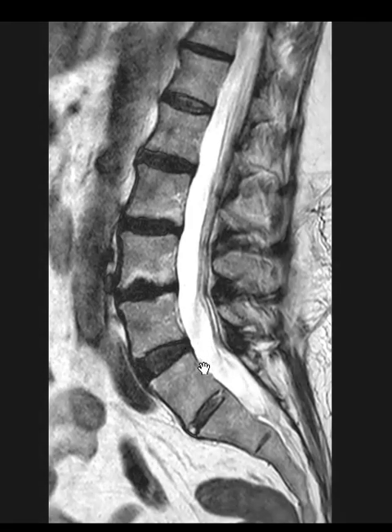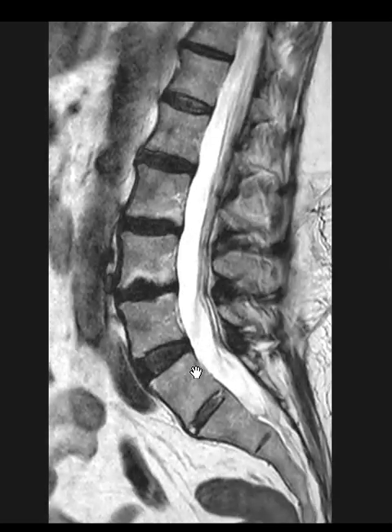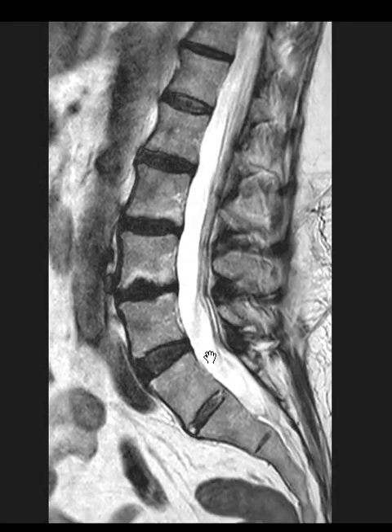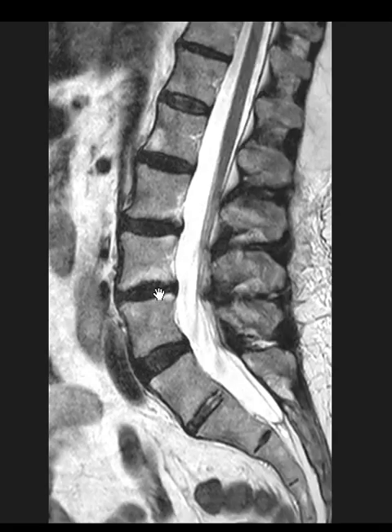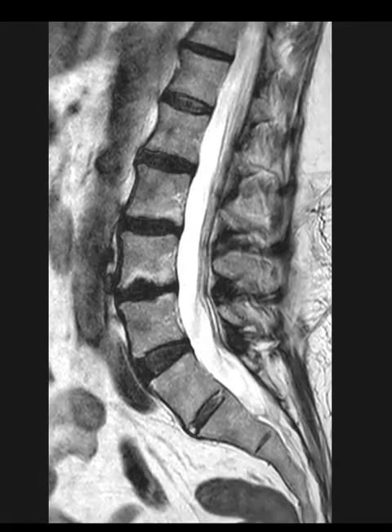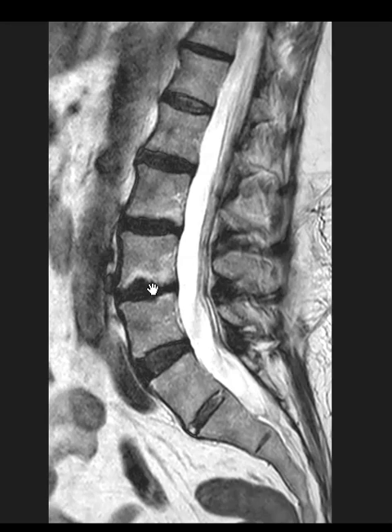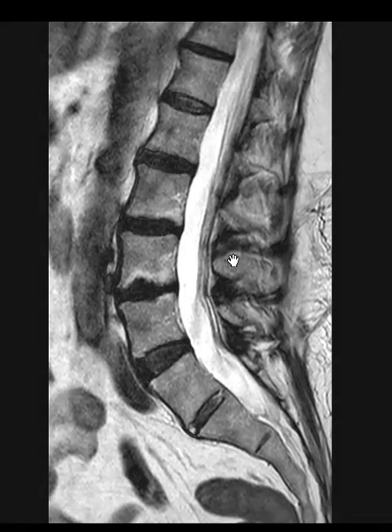The prior examination described a transitional segment and we're going to keep the same convention. This is really critical because if there is a disc abnormality and the surgeon has to do surgery here, they need to know what this is called — this could be L3-4 or L4-5, depending on who read it. And that's it. Thank you very much.